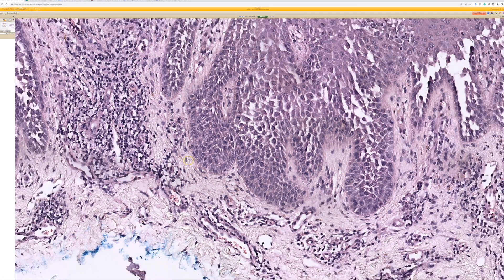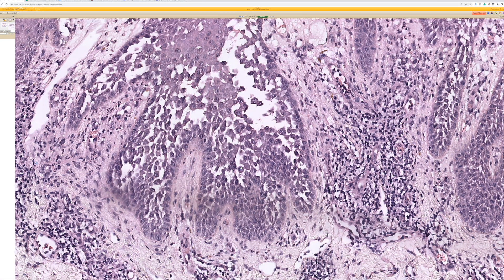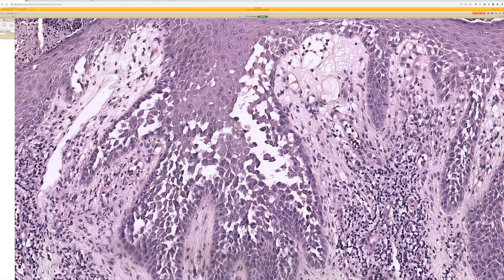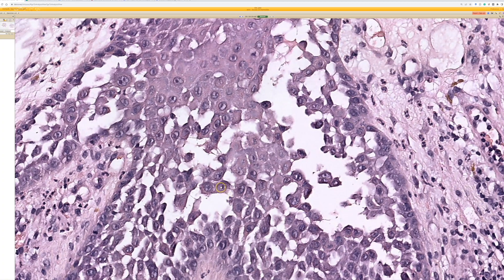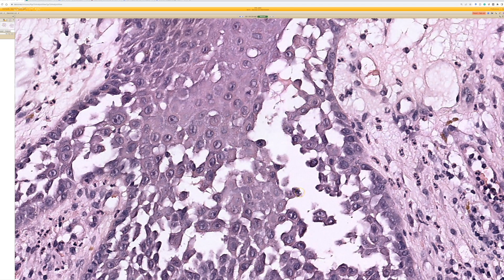In a more nicely stained specimen, the keratinocyte cytoplasm becomes more dense and more pink as the cell rounds up — the keratin filaments get thicker, less stretched out, making the cytoplasm look denser and more pink, as you can start to appreciate in these cells here. Those are all clues pointing to acantholysis, and that's important because only a handful of diseases show this feature.